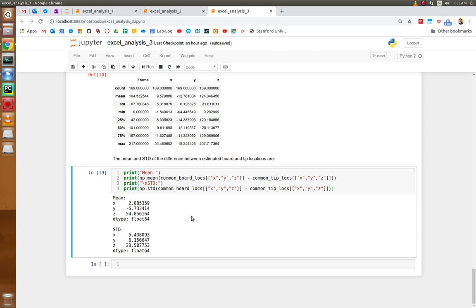So that's the analysis, and I hope this gives us an initial idea of how DOPE is performing and how much we have to improve the performance, maybe using DOPE, maybe using something else, but this probably will have to be reduced.